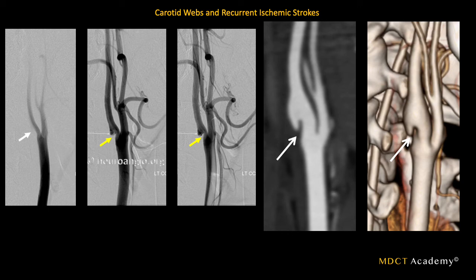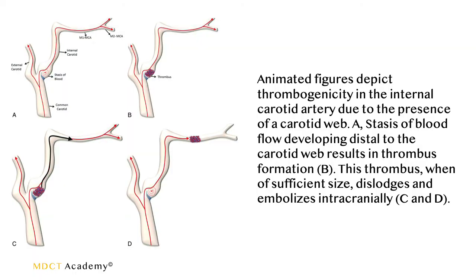Looking at images A through D: if you have a fibrous cap, thrombus formation occurs at the carotid web. With any movement or turbulent flow due to increased blood pressure, the clot can be dislodged, travel up into the brain, and cause thrombosis or blockage of the middle cerebral artery. This is why optimal enhancement of the carotid arteries during carotid CTA is so important.